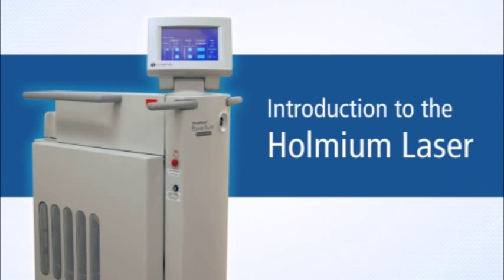Introduction to the Holmium Laser. This video is intended to provide an overview of the main safety features of a Holmium Laser and how it works.